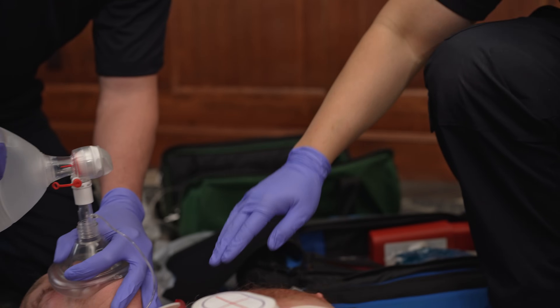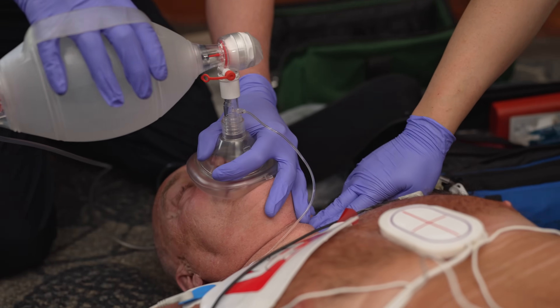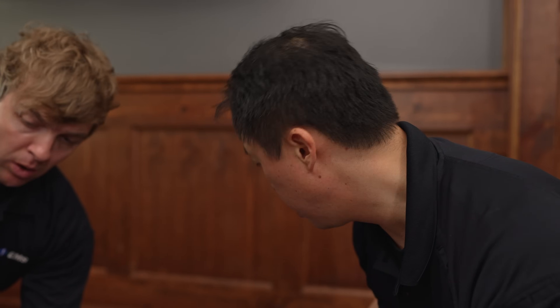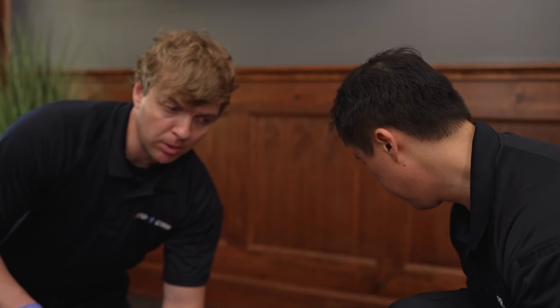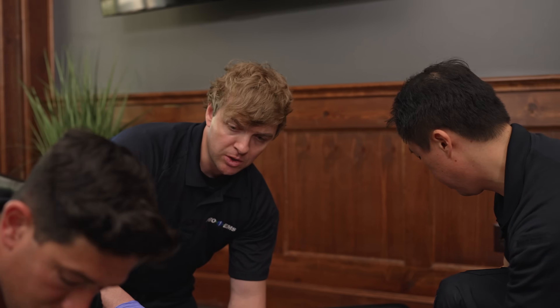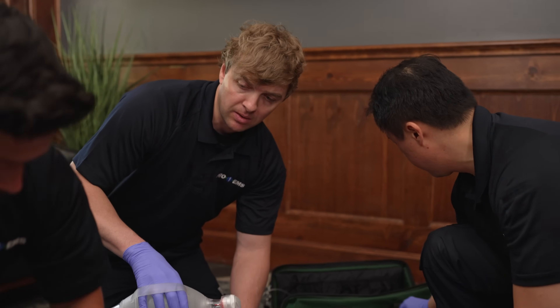Rhythm check. I've got a sinus brady. I've got a strong pulse. All right, let's bring out those 12-lead cables, put a blood pressure cuff on. I also want to think about getting another IV going.